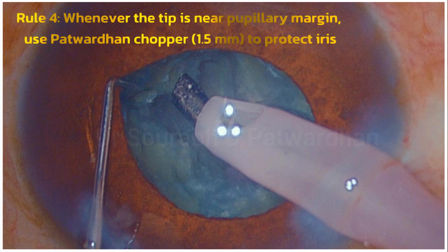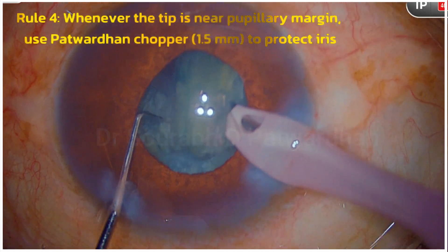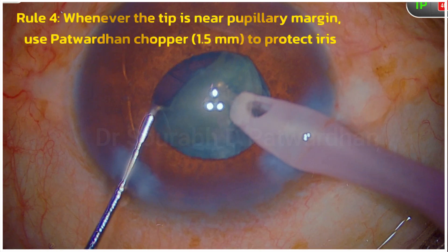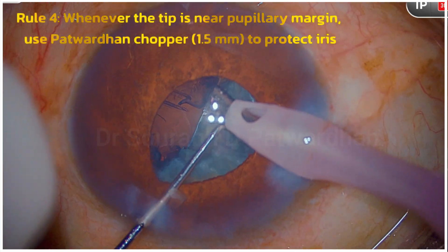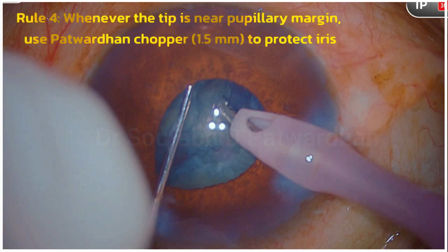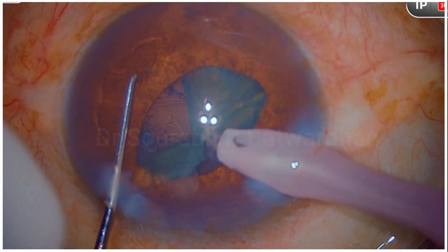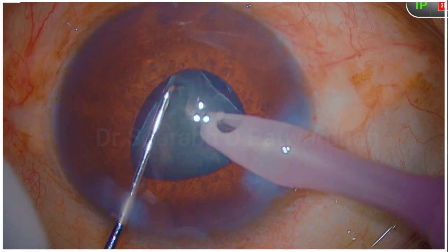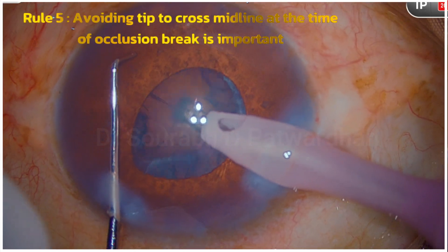Whenever I use higher vacuum near the pupillary margin, I use the chopper to avoid getting the iris into my phaco tip. Once the piece is pulled out, I bring it to the center. Do that every time when you feel your tip is going too close to the pupillary margin, and make sure the phaco tip remains at the center. Try to avoid crossing the midline often, because once you cross it there is a high likelihood you might pull the iris. At the time of occlusion break, you should withdraw the phaco tip toward the center, avoid going closer to the iris, and use the second-hand instrument to keep the iris retracted away.